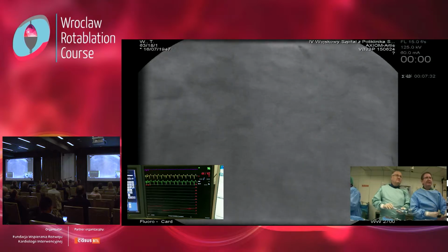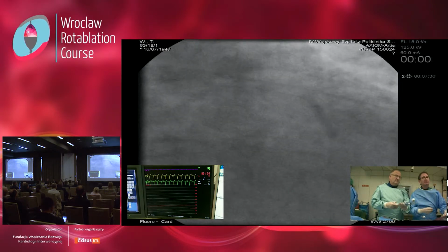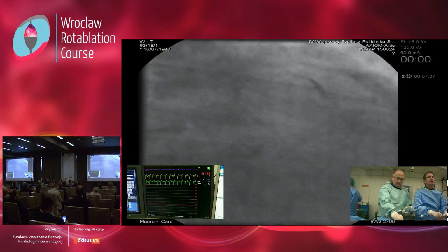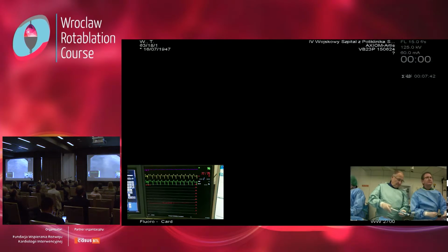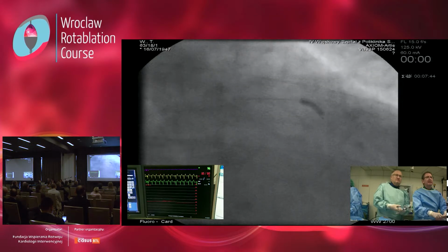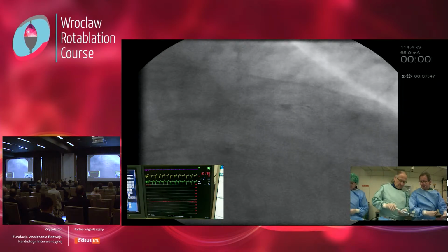We go now with 10, 14 atmospheres. So the balloon is well open, very nice. We go a bit back. One more. Okay, negative. Okay, again, 16, 18.